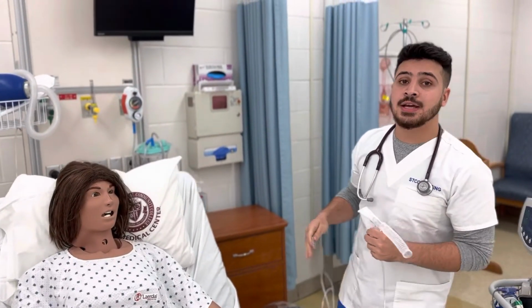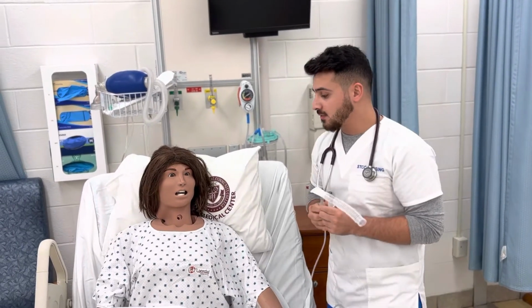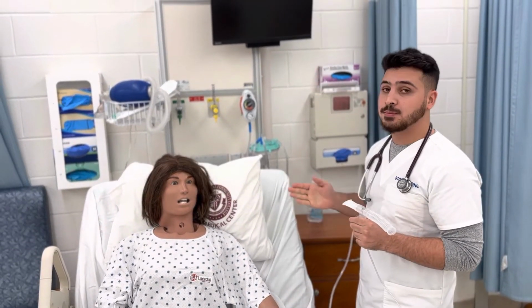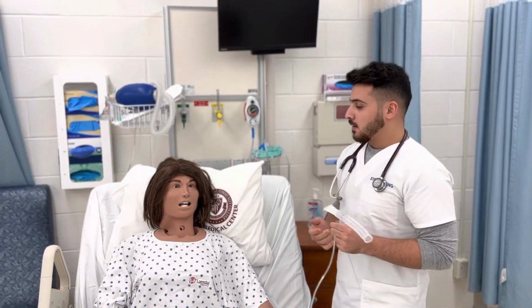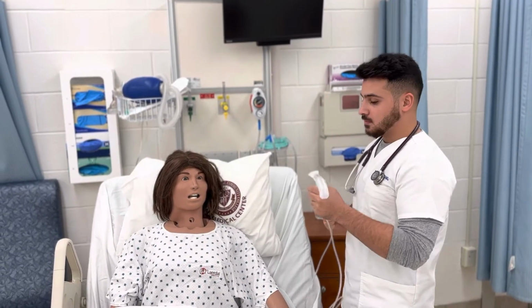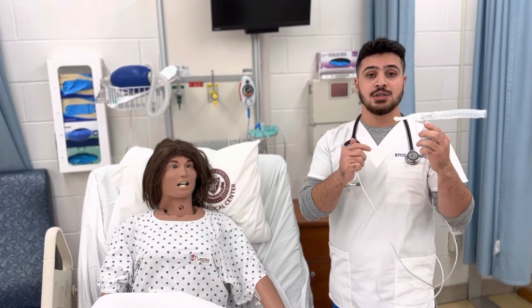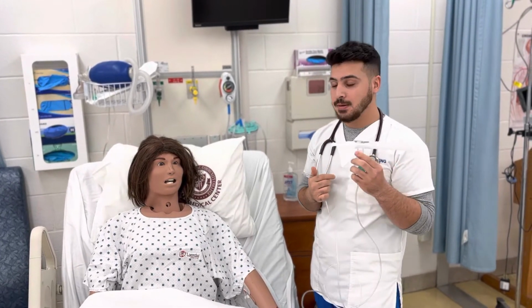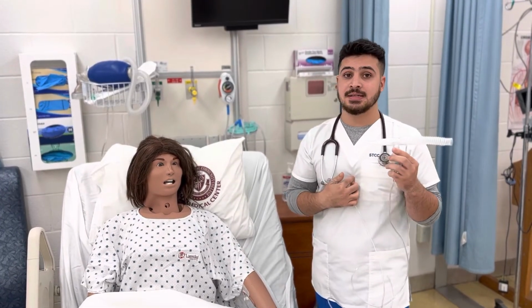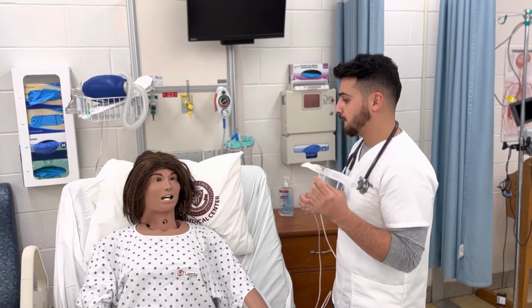Now we're going to educate the patient on how to inhale the nebulizer treatment. First, you have to make sure the patient is sitting in an upright position, so that will help the patient inhale easily. Second, tell the patient to keep the mouthpiece between their lips, inhale the medication, and hold it for a couple of seconds, so that will allow the patient to expand their lungs and help them breathe better.